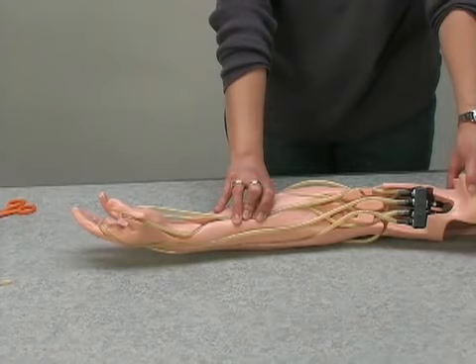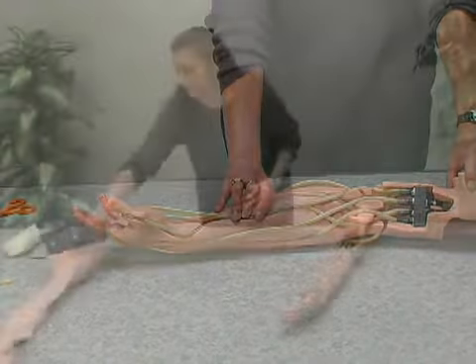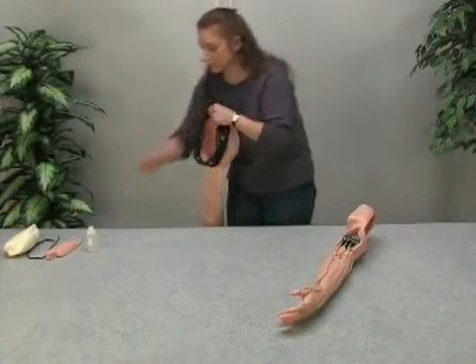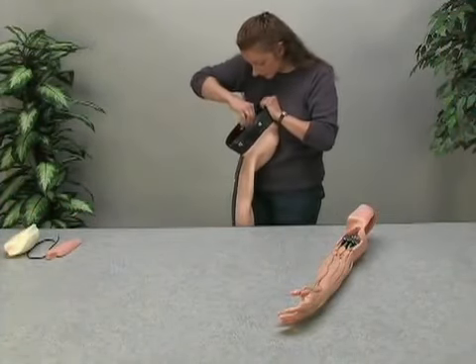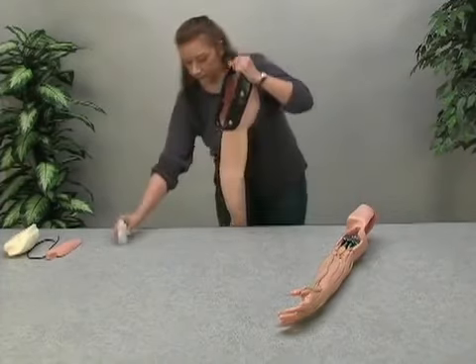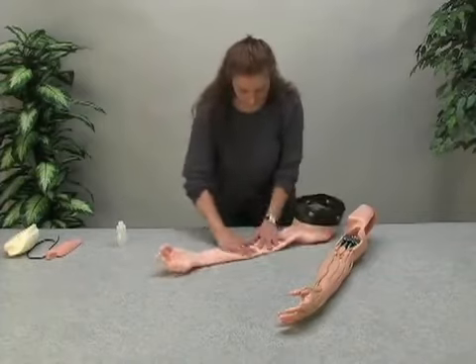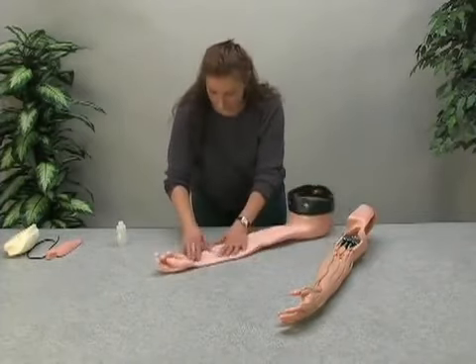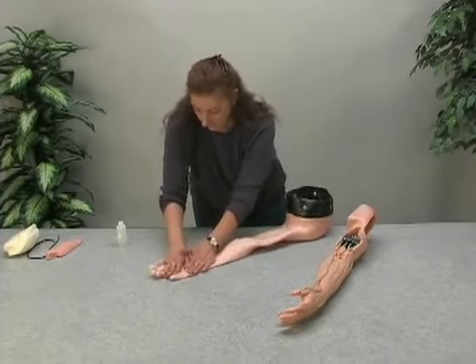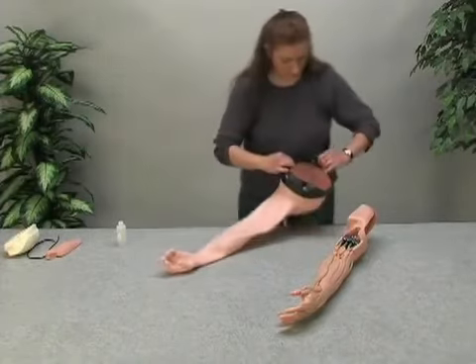After successfully installing the replacement veins in the arm, you are now ready to install the replacement skin. First, pour the remaining lubricant in the skin, allowing it to run down the sides. Massage the lubricant, working your hands back and forth, up and down, to coat the inside of the skin completely.